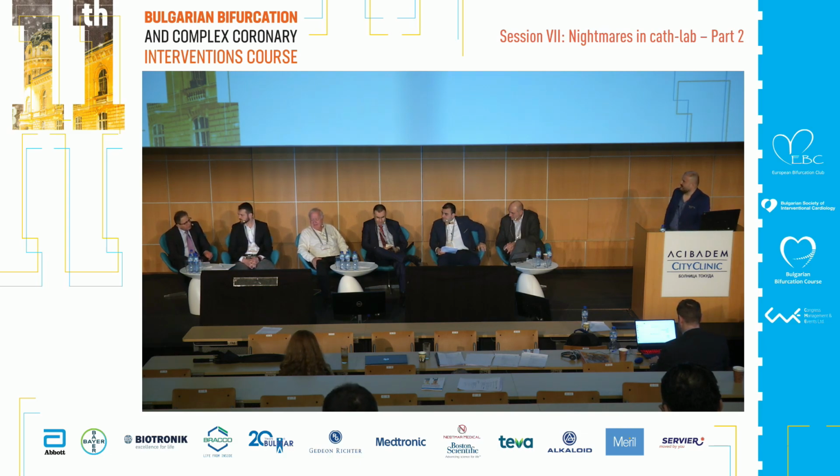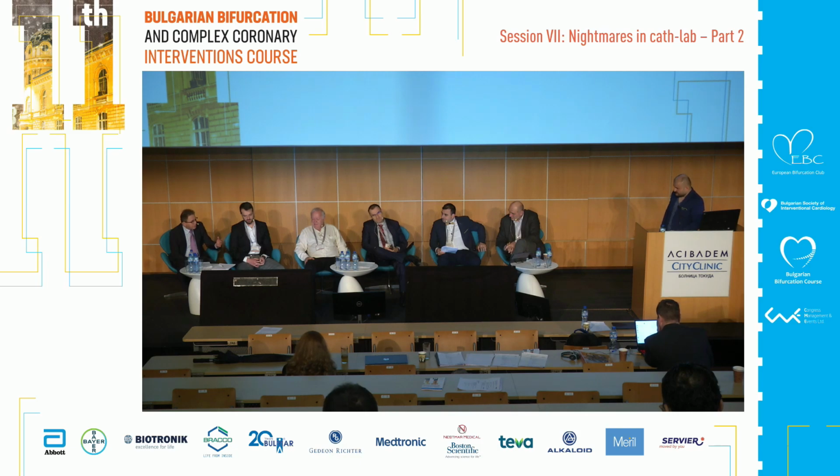Thank you. You reimplanted the stent for proximal LAD. Yes. I would like to discuss this topic. Why? Because by chance you had, let's say, a temporary stent for 1 month for proximal LAD, the most active phase of drug-eluting stent action. So I would base a potential delay of proximal LAD stenting on IVUS assessment.